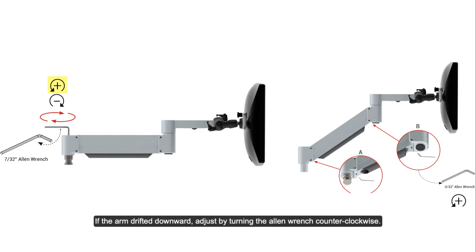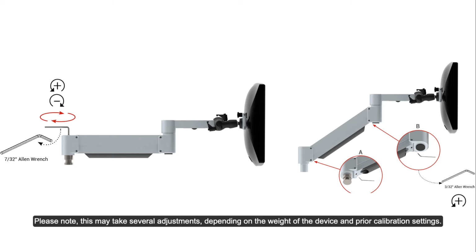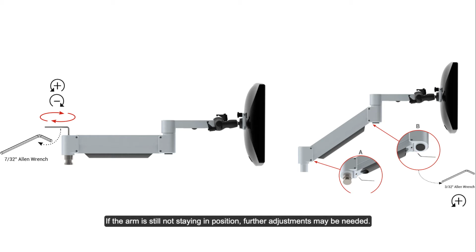If the arm drifted downward, adjust by turning the Allen wrench counterclockwise. If the arm drifted upward, adjust by turning the Allen wrench clockwise. Adjust the arm calibration until the arm remains in place when positioned straight. Please note this may take several adjustments depending on the weight of the device and prior calibration settings. If the arm is still not staying in position, further adjustments may be needed.